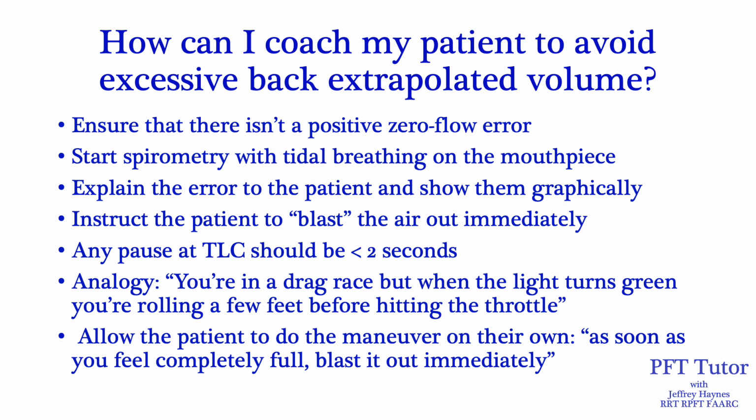When patients are having problems with this error and I'm trying to explain to them, I use this analogy that you're basically in a drag race and the light is turning green. And as soon as it turns green, you're rolling a few feet before you hit the throttle. So as soon as the light turns green, hit the throttle.